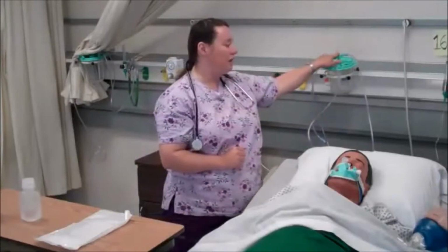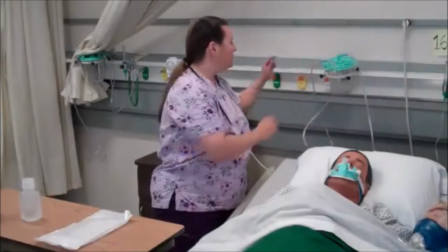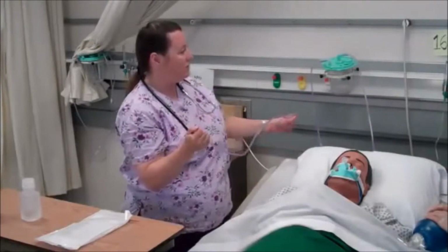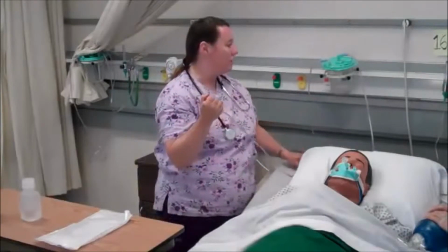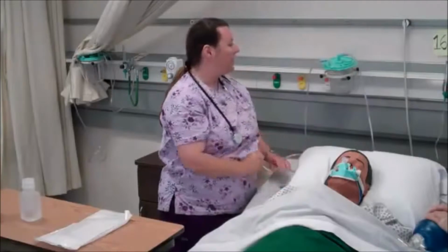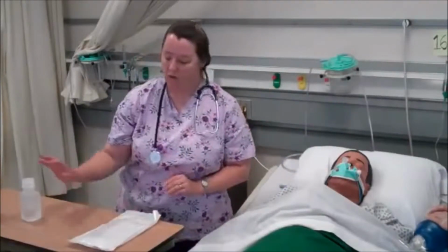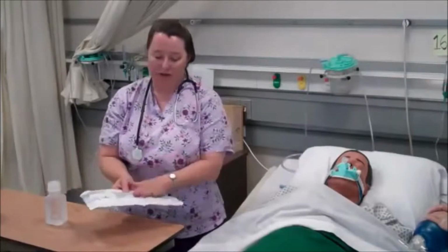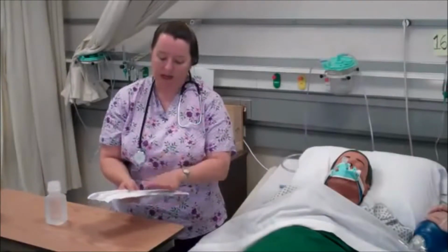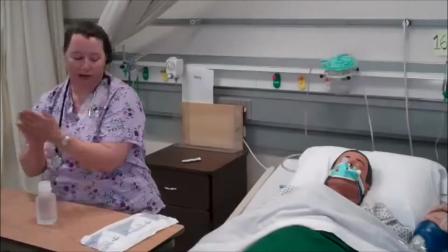I need to make sure that my vacuum source is available and working. I'm going to make sure that when I put pressure over the vacuum tube, it does not go above 120 millimeters of mercury for pressure. And I have that ready, set to go. I'm going to get my equipment ready here. I have made sure that everything is appropriate sizing, the appropriate kit, and that nothing is expired on my equipment. I'm going to go ahead and wash my hands.